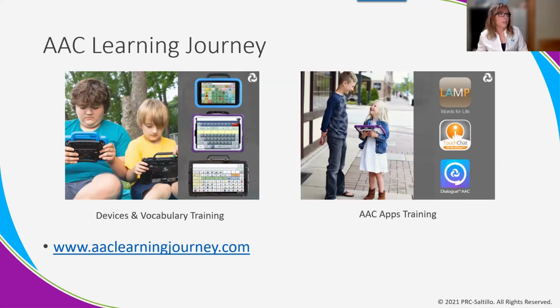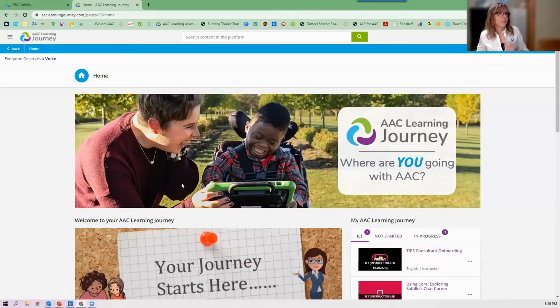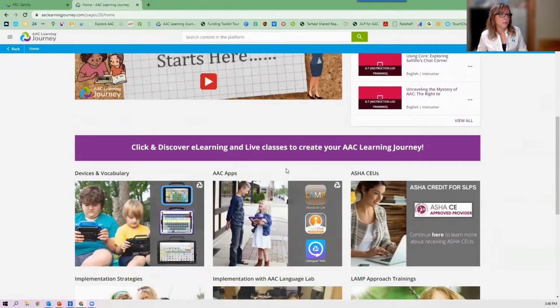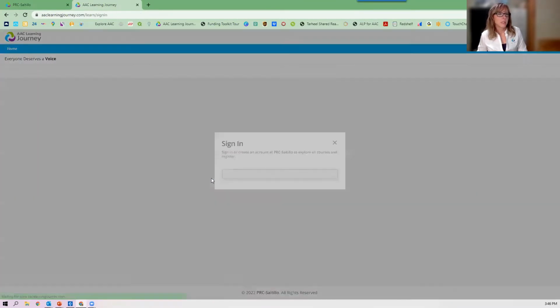And so we have the AAC Learning Journey, and I'm going to show you that. You would want to create a free login with our PRC-Saltillo account. Once you've logged in, you're able to then scroll in and check out device specific.